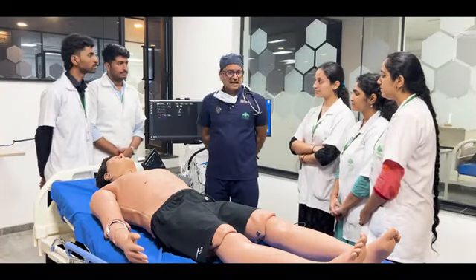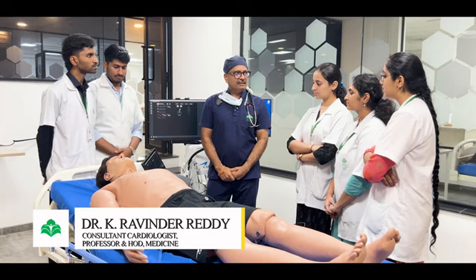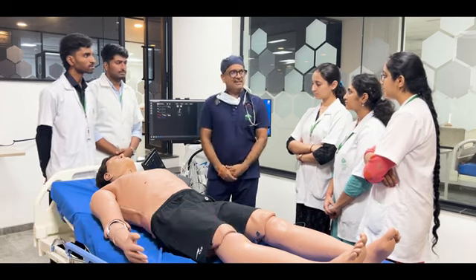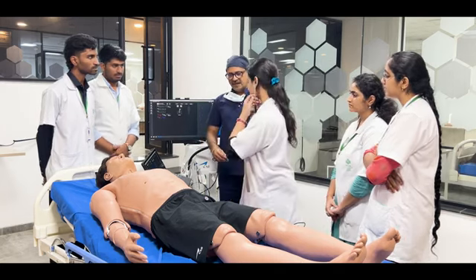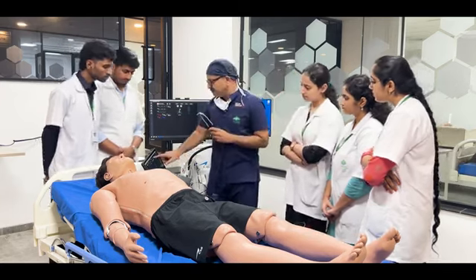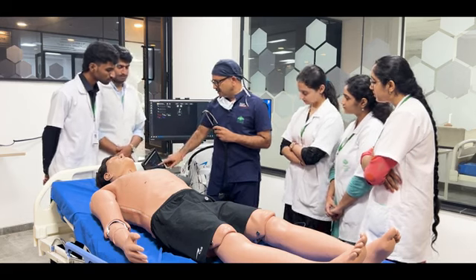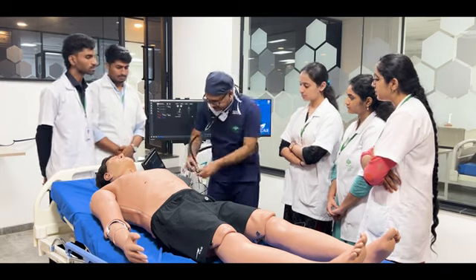Today we're going to learn about cardiac auscultation. So it has an audio-visual component where you can auscultate through your stethoscope and hear the various murmurs, systolic murmurs, diastolic murmurs, additional sounds like S3, S4. I will just show you how to auscultate. Probably I'll show you one pansystolic murmur right away. We're going to program such a way that we get a pansystolic murmur. Okay. Then all of you auscultate in the mitral area.